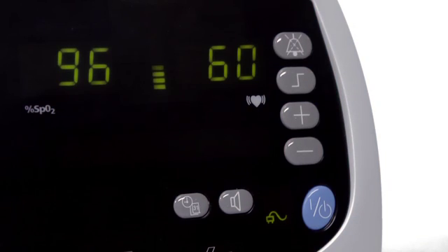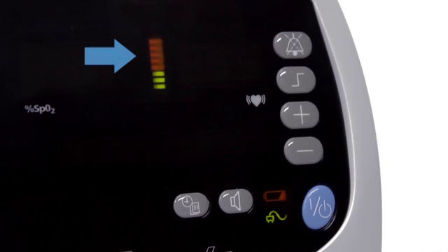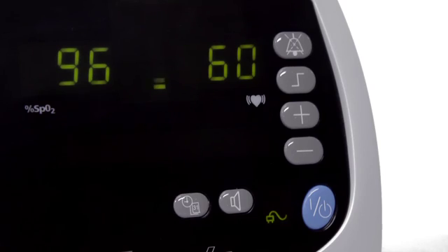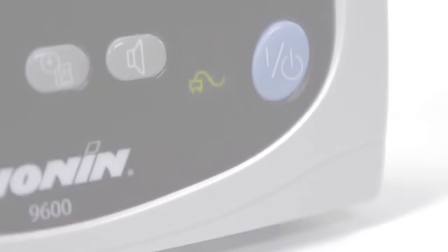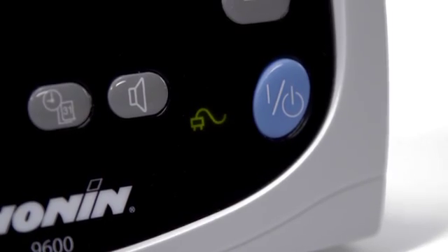The battery level indicator displays even when the oximeter is running on external power. With the oximeter running, momentarily press the on-off button and the pulse strength bar LEDs will display the battery charge. Amber represents depleted capacity and green indicates available battery capacity. The battery will charge while the oximeter is running on external power.